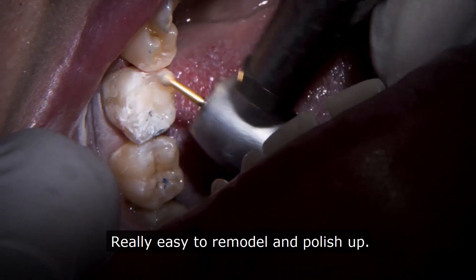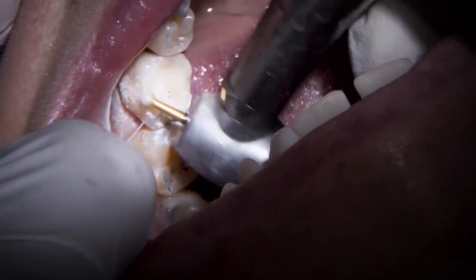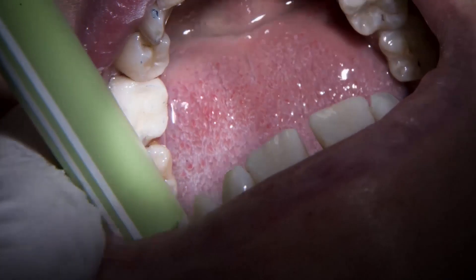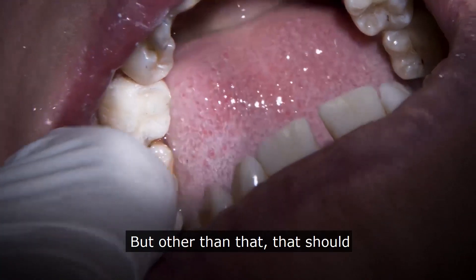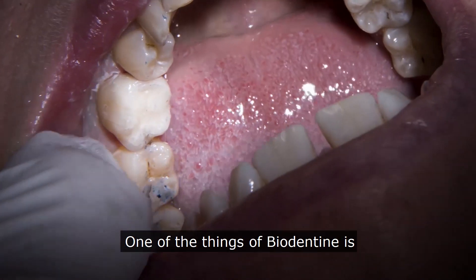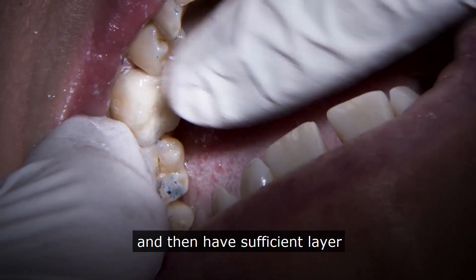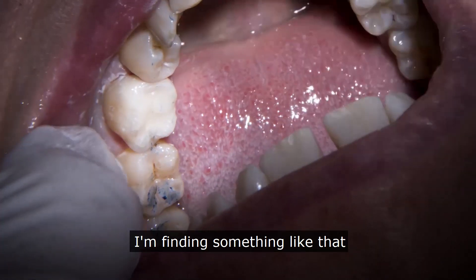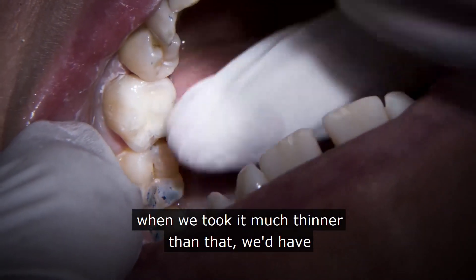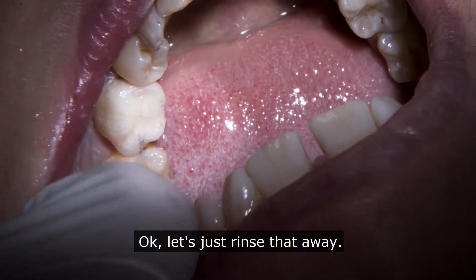Really easy to remodel and polish up. You've got a few little blue marks on your teeth where we've been checking your bite, but other than that it should feel and look pretty nice. One of the things with biodentine — it's always difficult to judge just the depth of dentine and to have a sufficient layer; it can catch you out and you can have a really tight bite at the end. But something like that would be just about ideal. When we've taken it much thinner than that we'd have little pockets wearing through, but you just run into that and top it up with your white filling material.